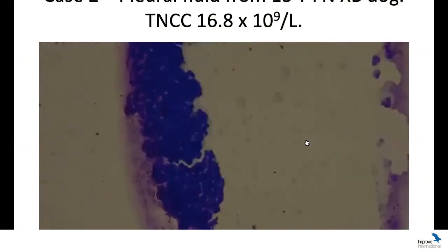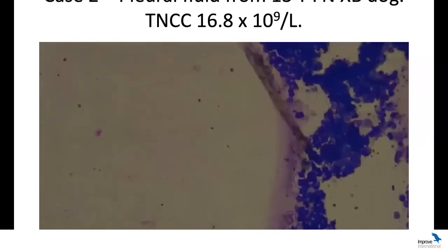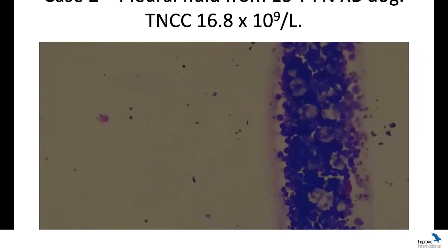a really high number of these cells in a concentrated space. And it was so thick that in some areas it had been washed off when we did the staining. And that's fine when those big chunks of material are washed off, because they would have been too thick for us to look at under the microscope anyway. So in this line smear, and we can do this also at the lateral edge of the smear, we are going to see this concentration of the cells that are heavier and that are of interest.